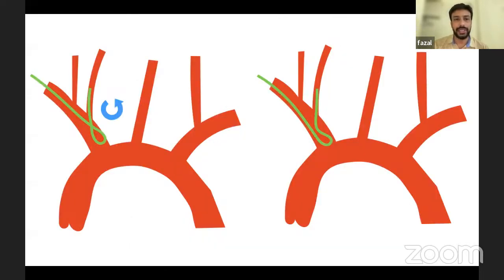This diagrammatic representation shows whenever it is taking a knot or a figure of 8 configuration. Whenever you twist it, it does not go up. Sometimes you might be doing it for a procedure. If you want to maneuver the catheter distally further into either an ECA shoot or the CCA, then you need to untwist the knot, and it goes slowly. You see that it will track distally. Whenever you try to take a wire, it goes. Whenever you try to push it with the knot, generally it doesn't go. The knot or the figure of 8 configuration helps when you want to push it distally into the arch.